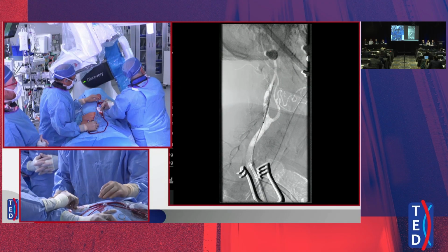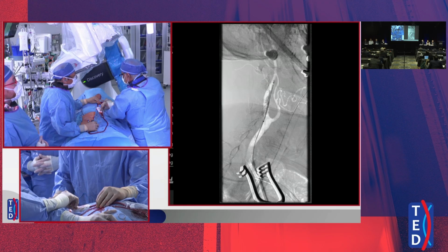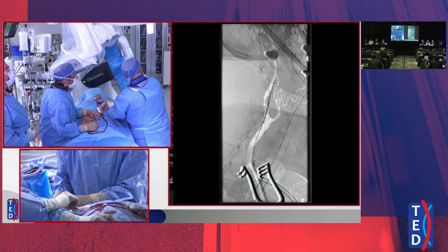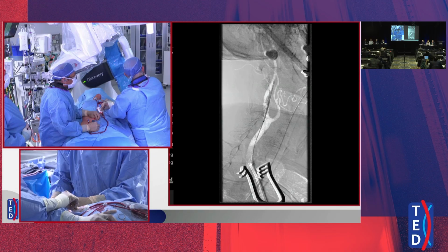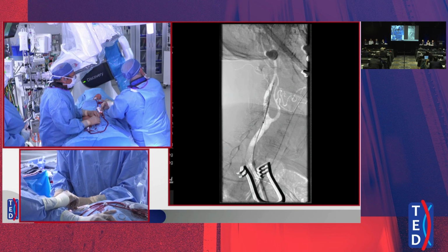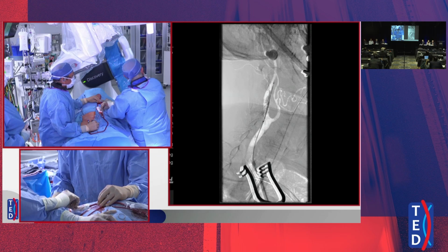I think if you deploy it there, Venki, the proximal end is going to open up nicely where the torsion point in the carotid is. So I think you have to deploy there and extend into the common. I don't like to have the stent sitting right where the bifurcation is. What if I land it here in the internal?